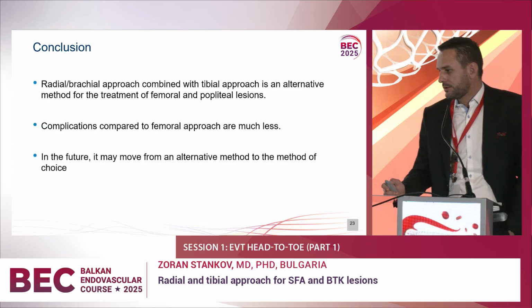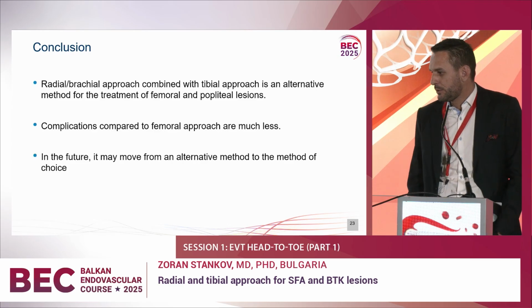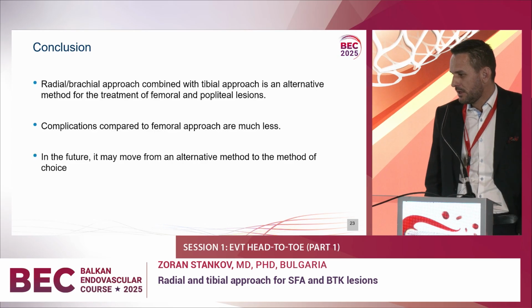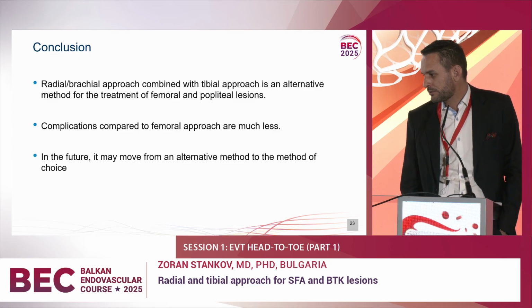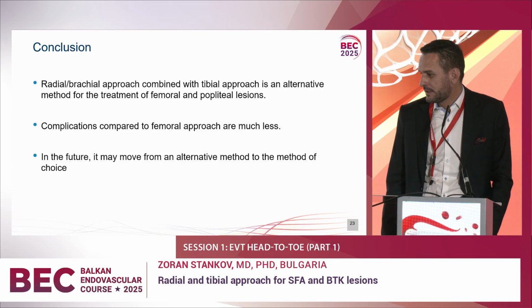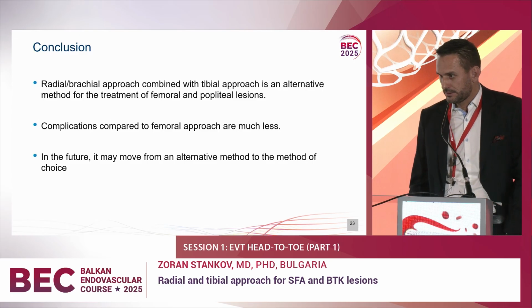In conclusion, radial brachial approach combined with tibial approach is an alternative method for the treatment of femoral and popliteal lesions. Complications compared to the femoral approach are much less. In the future, it may move from an alternative method to the method of choice. Thank you.